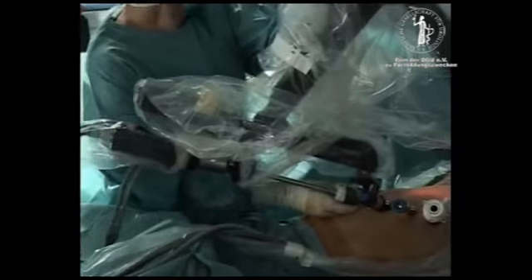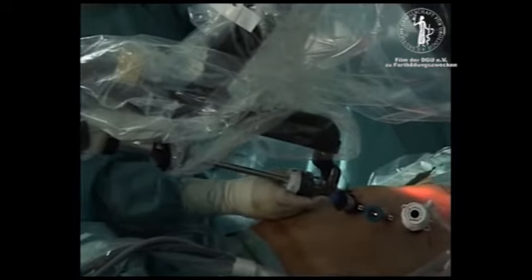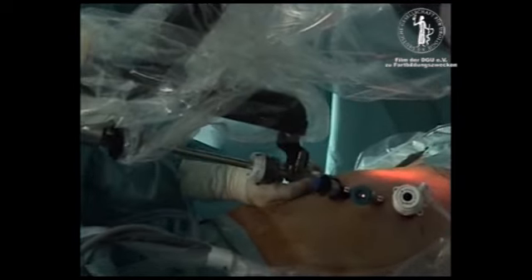The camera arm is used to lift the abdominal wall, creating extra space. If necessary, the camera trocar can be withdrawn slightly at this point, allowing more camera movement.